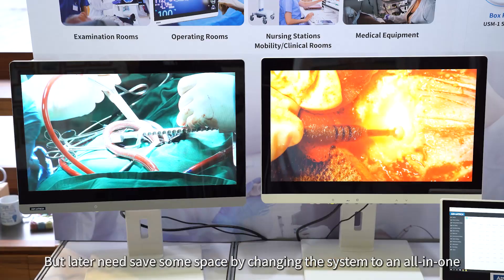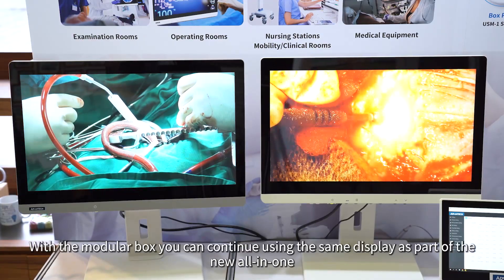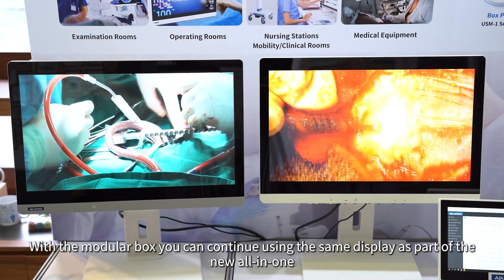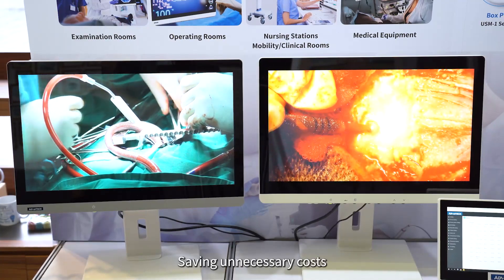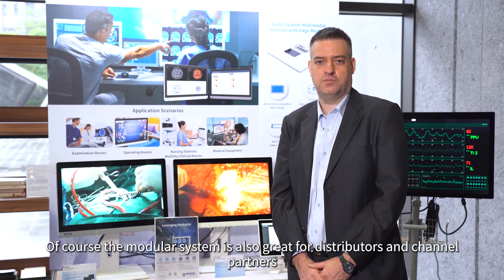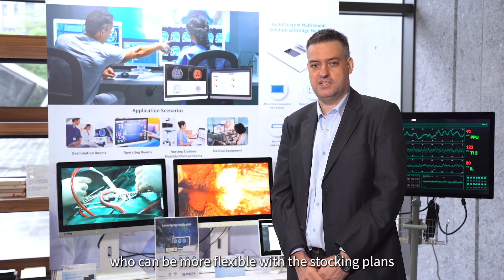By changing the system to an all-in-one, with the modular box you can continue using the same display as part of the new all-in-one, saving unnecessary cost. And of course the modular system is also great for distributors and channel partners who can be more flexible with their stocking plans.